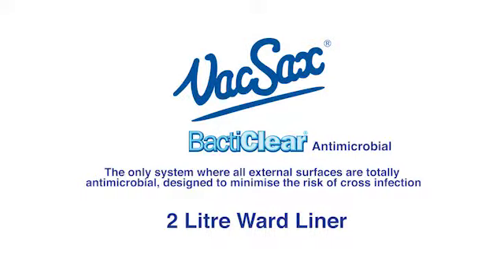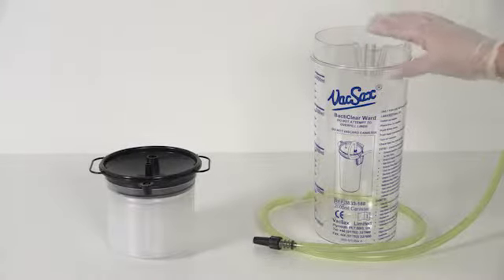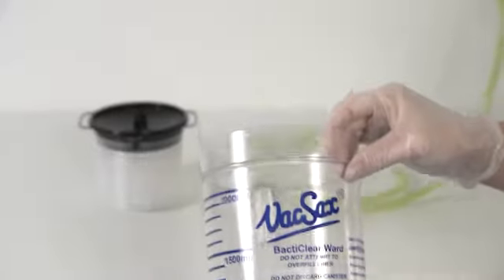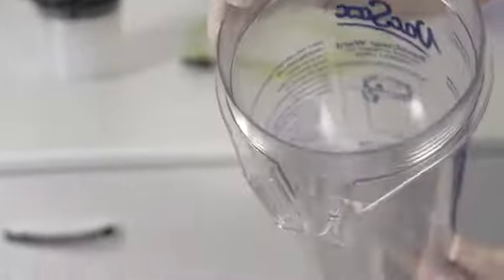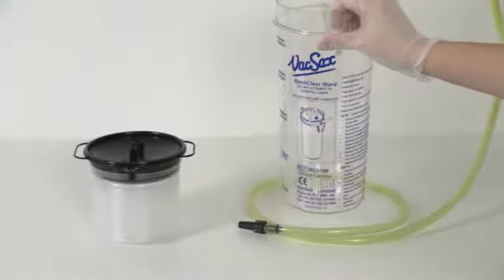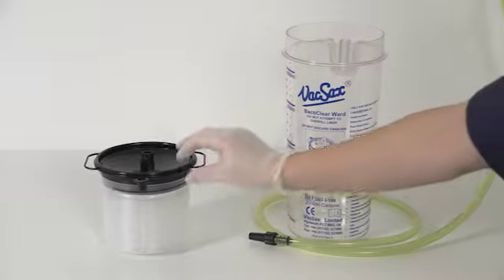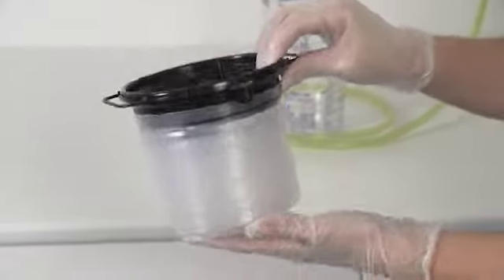The Bacticleer 2.0L Ward Liner. For this you will need one 2.0L Bacticleer Ward canister with rear vacuum port, and one 2.0L Bacticleer Ward liner with a unique smooth surface for ease of cleaning.